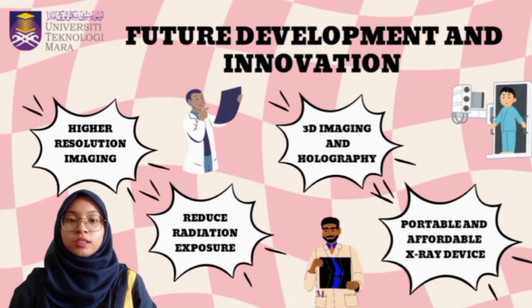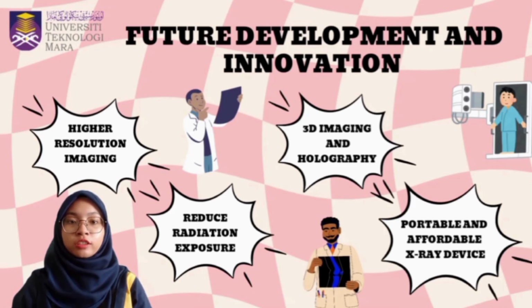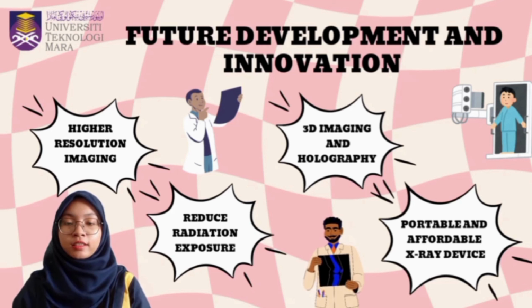Next are future developments in X-ray imaging. First, high-resolution imaging. This could enable more detailed visualization of internal structure, possibly at the cellular or molecular level, significantly enhancing early disease detection and diagnosis. Second, reduced radiation exposure.